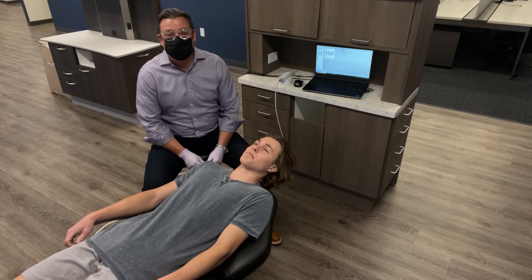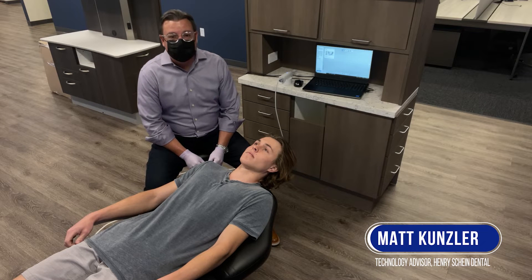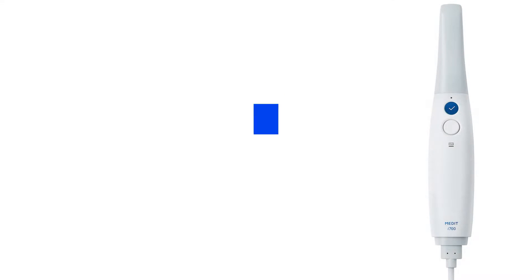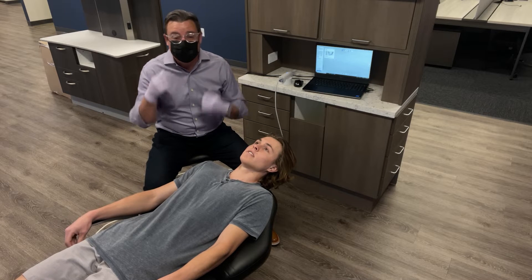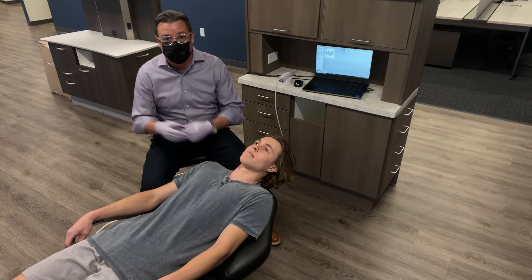Hey everyone, my name is Matt Kunzler. I work with Henry Schein Dental as a technology advisor, and today they have asked me to demonstrate the i700. My son Colin is not an actual patient, and I'm not an actual doctor, but I am able to show you how quick and efficient you can scan in your office for your patients.